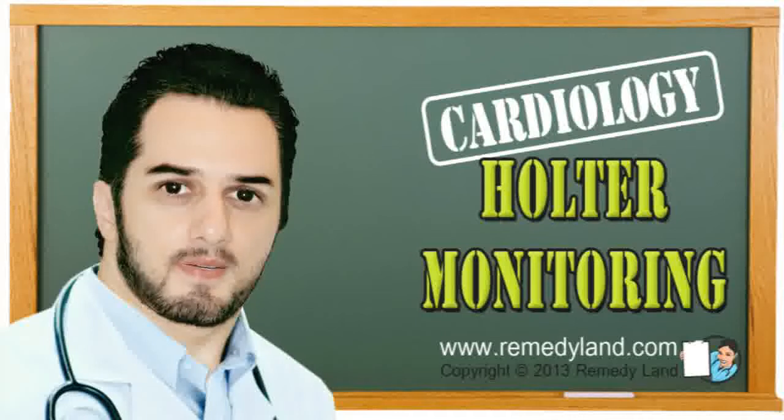Holter ECG monitoring is a non-invasive diagnostic procedure that is performed in ambulatory or hospital conditions. The patient places electrodes on the chest, which are associated with the device, sized like a mobile phone. The device, the Holter ECG, is recording electrocardiograms of the patient all the time.